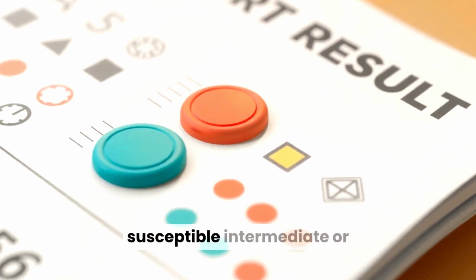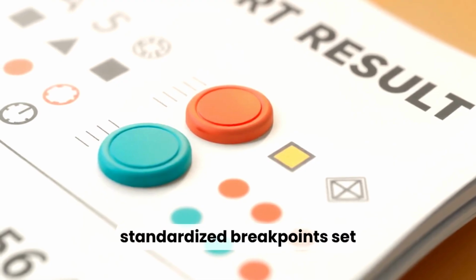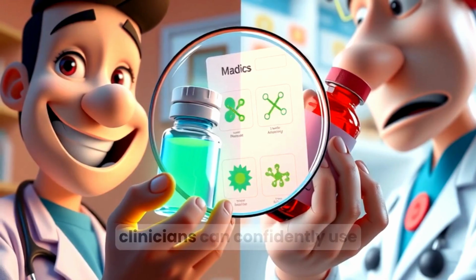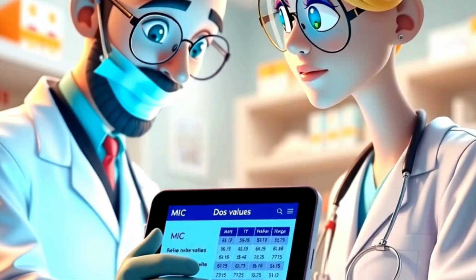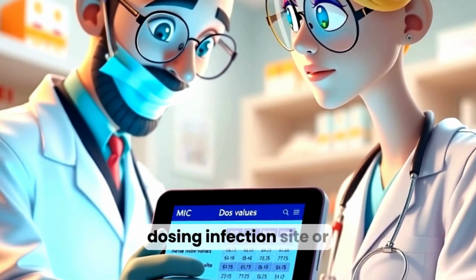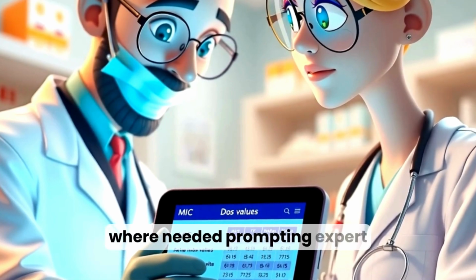Results are reported as susceptible, intermediate, or resistant based on standardized breakpoints set by experts and health agencies. If an isolate is susceptible, clinicians can confidently use that antibiotic. If resistant, the drug likely won't work and should be avoided. Intermediate results mean response may depend on drug dosing, infection site, or whether the drug concentrates where needed, prompting expert judgment.